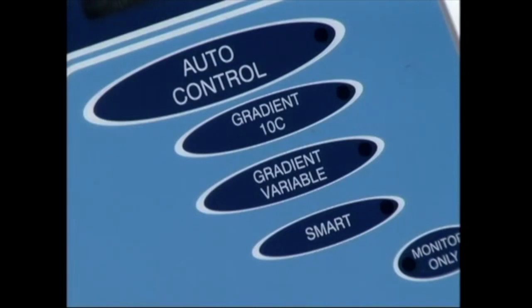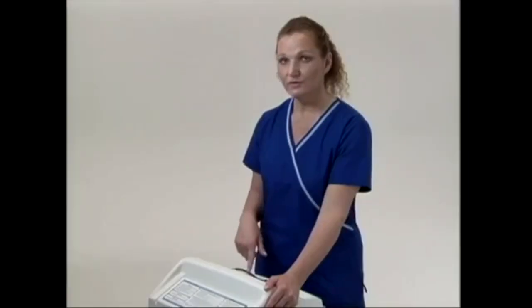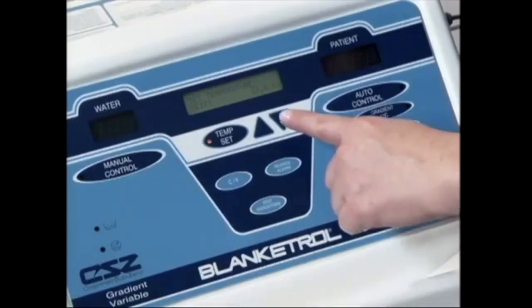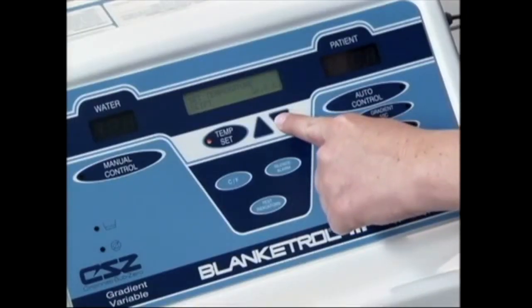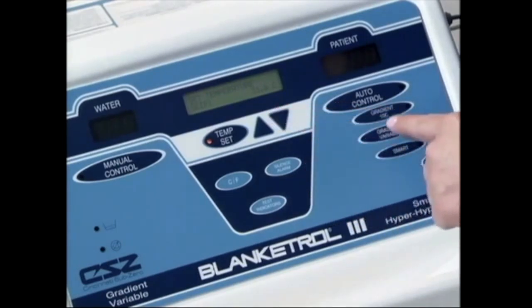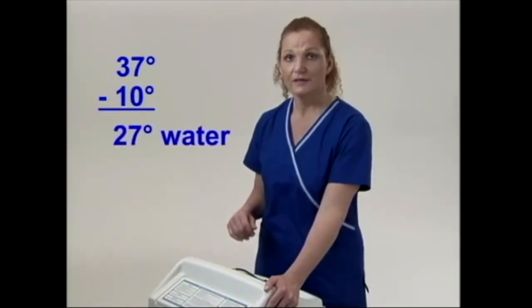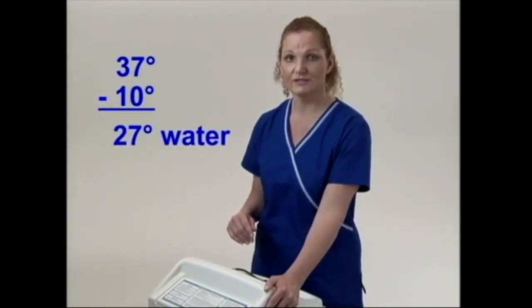To use the gradient 10 degree mode on the Blanketrol 3, all you need to do is make sure that your patient has a temperature sensing device in. Then press the temp set button in the center of the console. Using the up and down arrows, enter the desired patient temperature. When the desired patient temperature is entered, press the 10 degree gradient button. The maximum water temperature change will be 10 degrees higher or 10 degrees lower than your patient's body temperature, and the temperature in the machine will change based on your patient's needs.